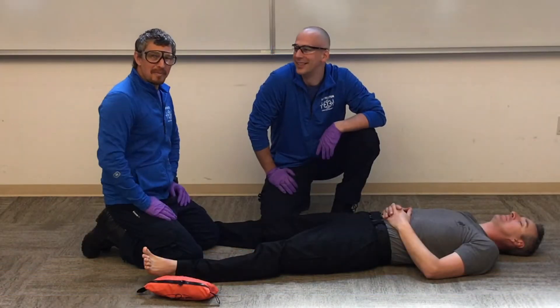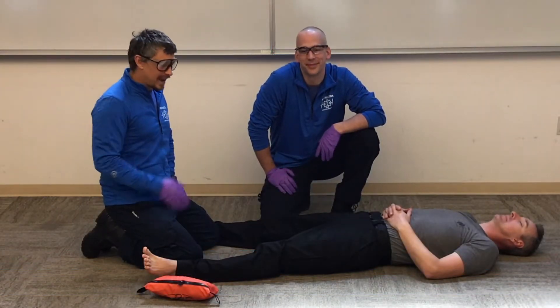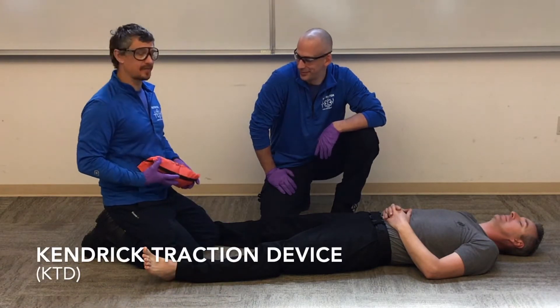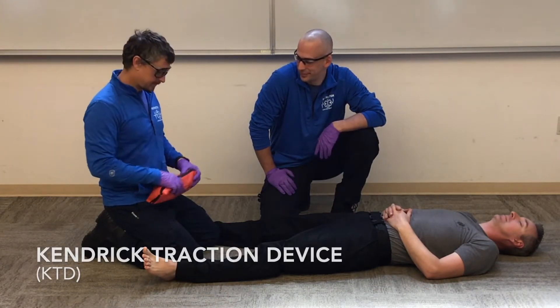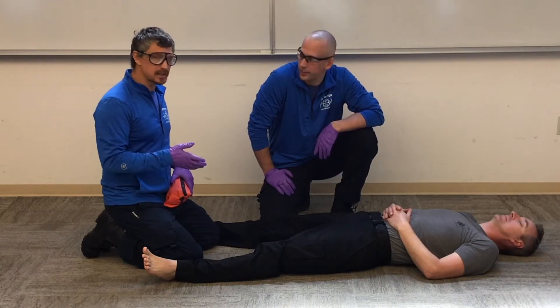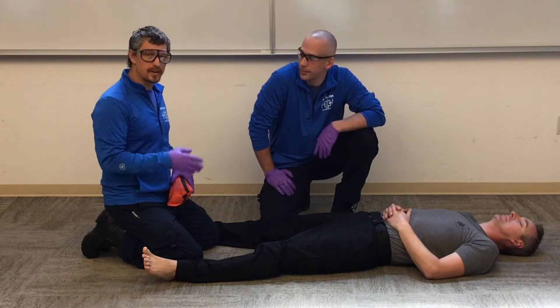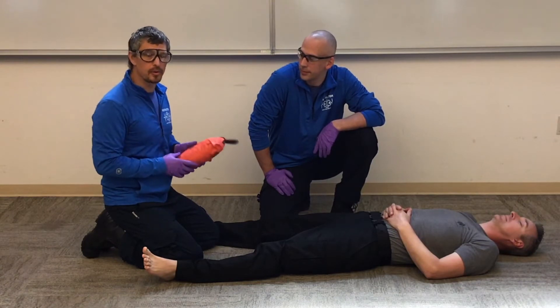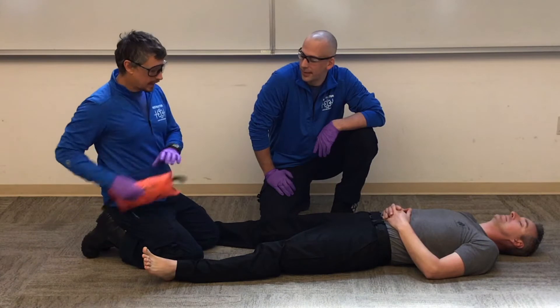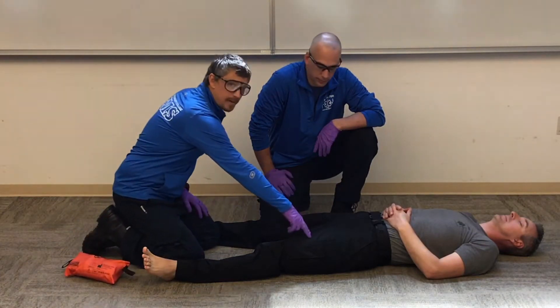Welcome back. Today we're going to look at traction splinting with the KTD — the Kendrick traction device. We've gone over a lot of the details when we did traction splinting with the Sager; we have that video. This we're just going to go through how the Kendrick traction device works. We have a mid-shaft femur fracture.